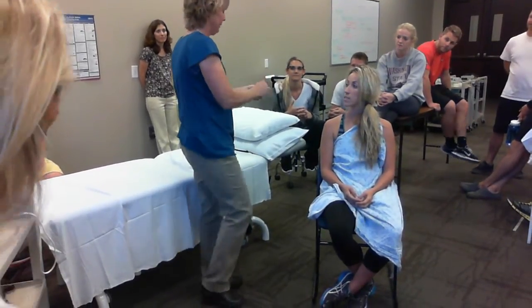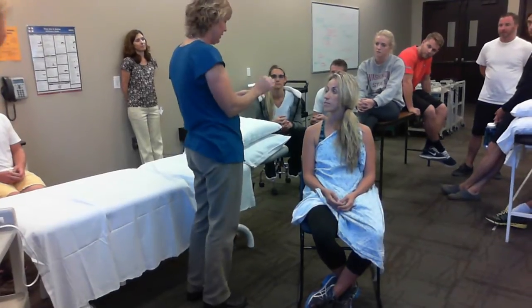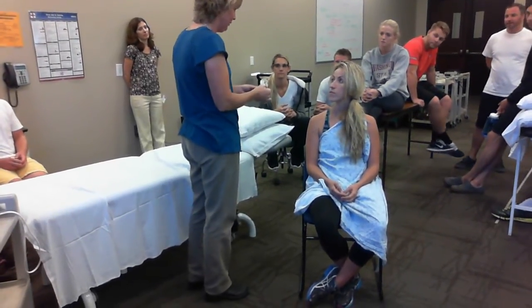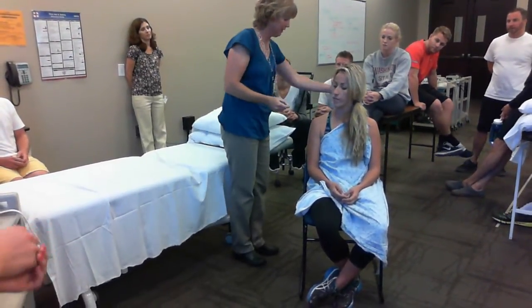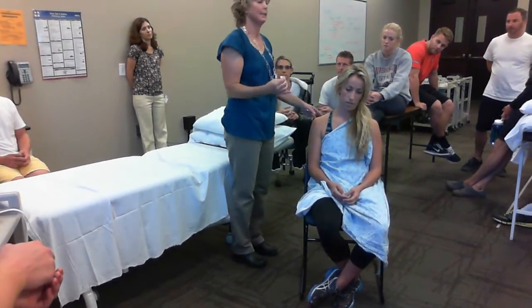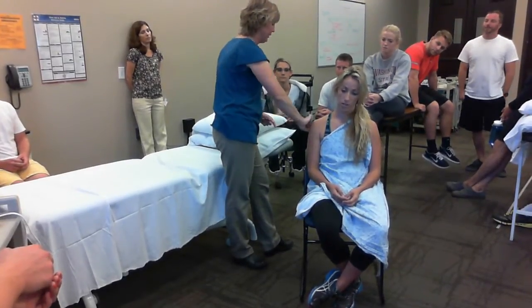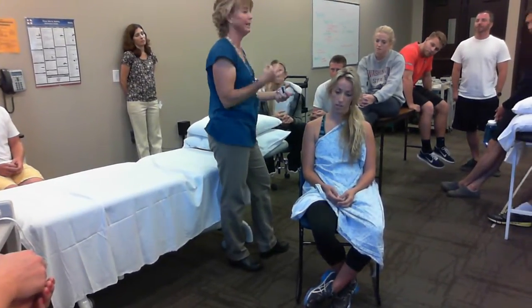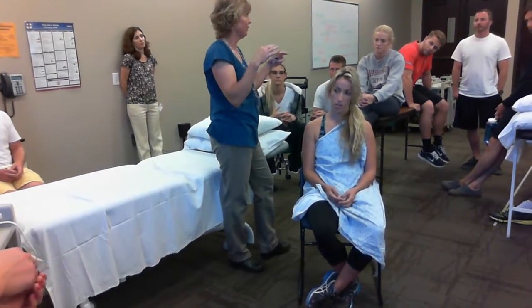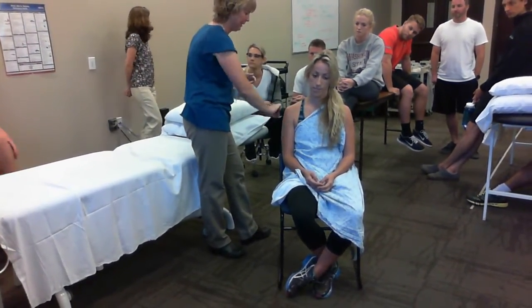Okay, so soap and water would be the best, right? But I'm going to just use some alcohol swabs to get the oils off. So first thing I'm going to do is get any oils that you have on your skin off, so the electrodes conduct better. On the side, I'm not going to explain this to my patient unless they ask. When you have oils on your skin, possibly you're going to have increased resistance, increased impedance to current flow, and so that can get uncomfortable for them. So I clean off all those areas where I'm going to be putting the electrodes.